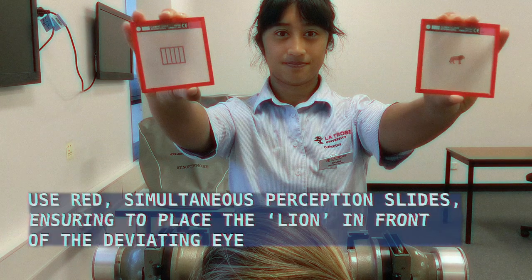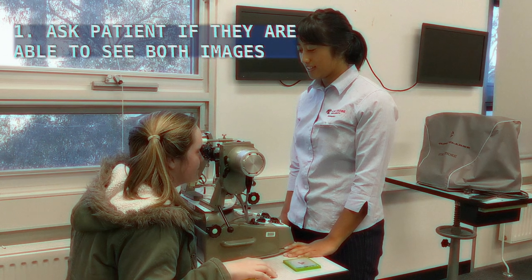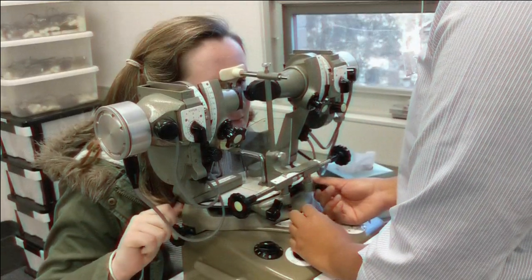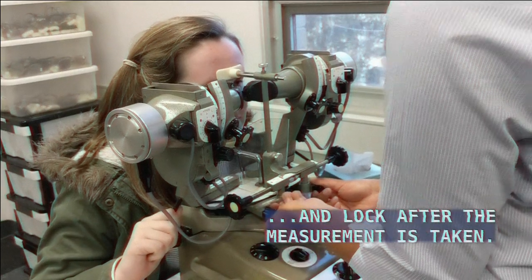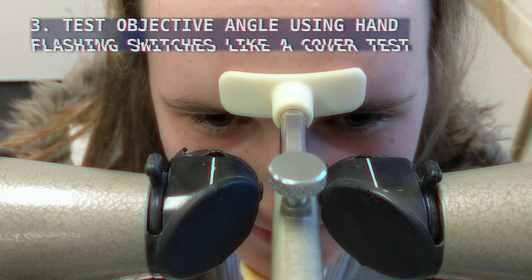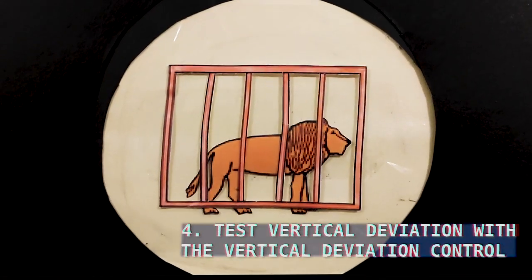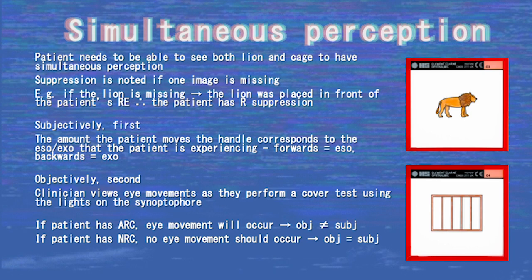Simultaneous perception slides consist of a pair of different images — here, the lion and the cage slides are used. The clinician asks the patient if they can see a lion and a cage, and whether the lion is in the cage. The patient uses the horizontal deviation control to move the lion into the cage, and the clinician uses the vertical deviation control to centre it. For simultaneous perception to be present, the patient must indicate that they see both the lion and the cage at the same time. If one is missing, suppression is evident, where the eye with the missing image is suppressed.